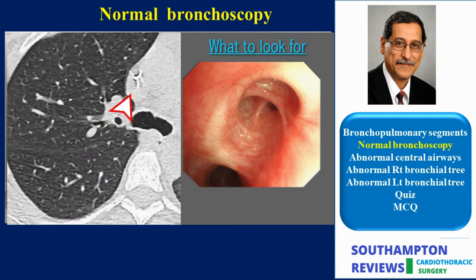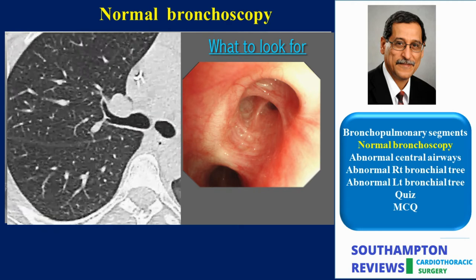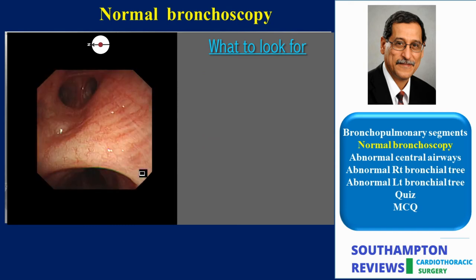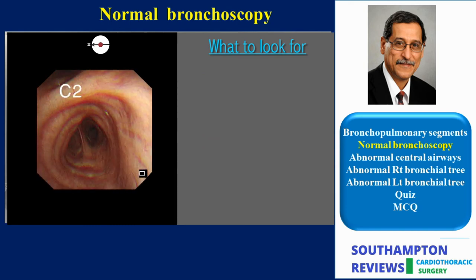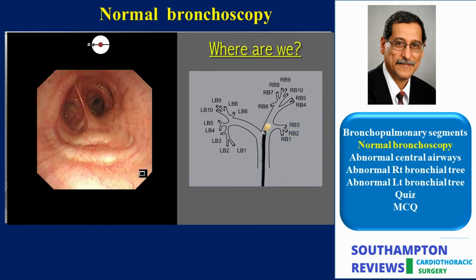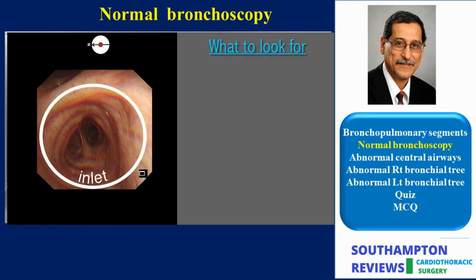On the CT scan in this case, the upper lobe bronchus is seen foreshortened all the way down to its origin from the right main bronchus, and then the anterior and posterior bronchi are seen branching from a common stem. We now move on to examine the bronchus intermedius. Again we need to define its territory precisely by defining its inlet and outlet, making use of the principle of carinae-to-carinae. We will first mark the secondary carina between the upper lobe and the bronchus intermedius, which marks the inlet, and the tertiary carina that separates the middle from the lower lobe, which marks the outlet of the bronchus intermedius.